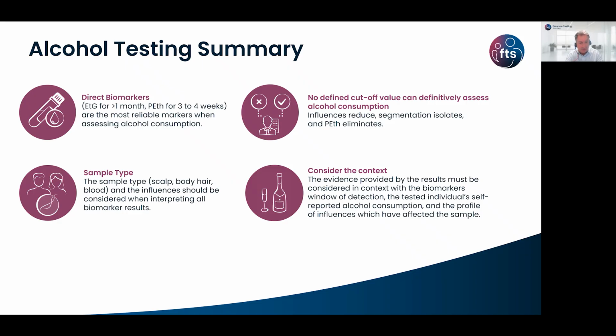I've gone through them in a little bit of detail in this webinar, but try and get to understand them a bit more, especially if you're instructing quite regularly for alcohol, and especially if you may have to appear in court or defend this evidence that you have in front of you. Get to understand the sample types and the influences and what should be considered when someone like us or a lab is interpreting all these biomarkers.